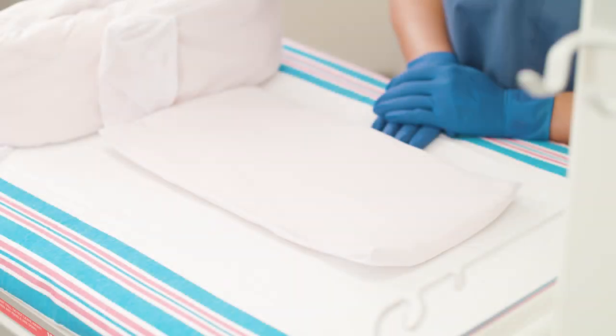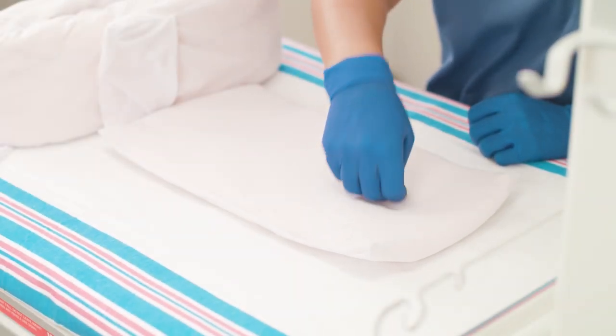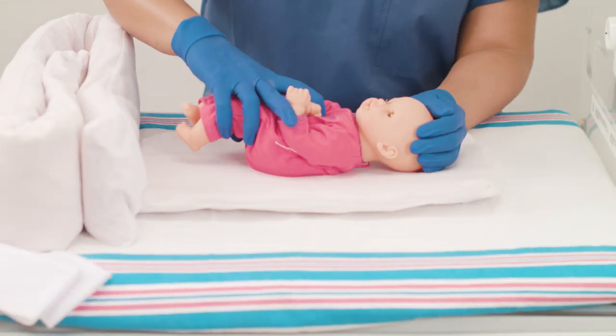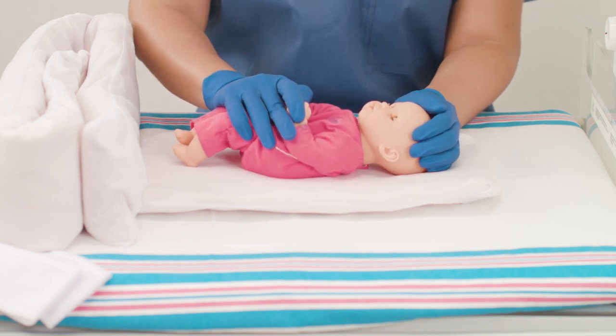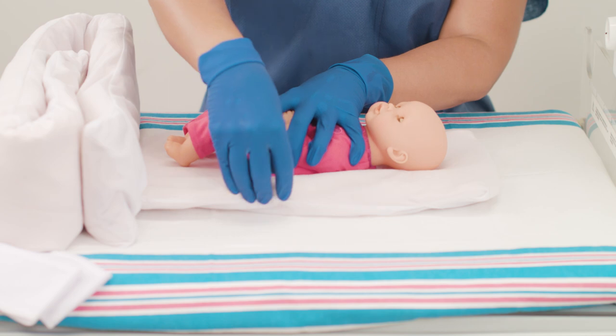For a supine position, place a full body positioner on the bed and create an indentation for the head. Place the infant on the positioner so its head is in the indentation. Gently mold the positioner around the infant to help maintain a contained position.